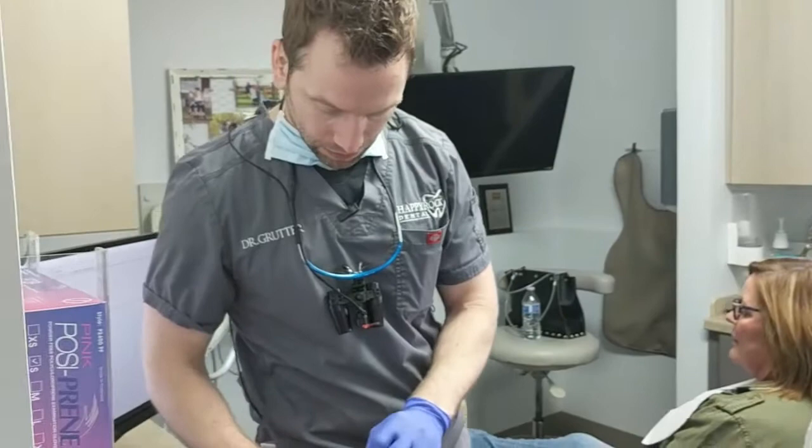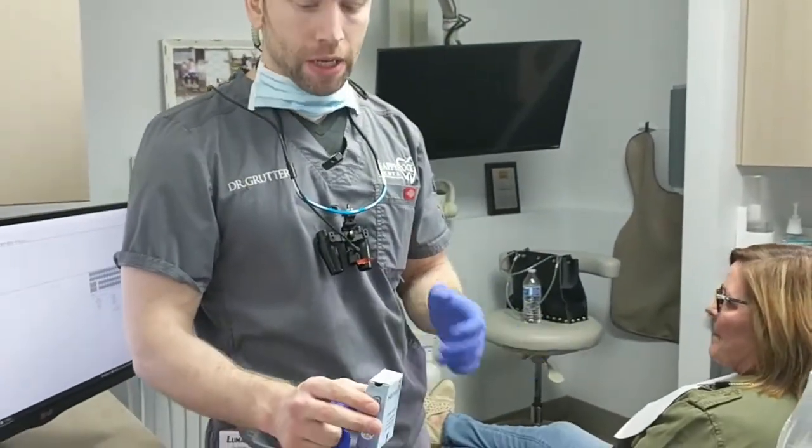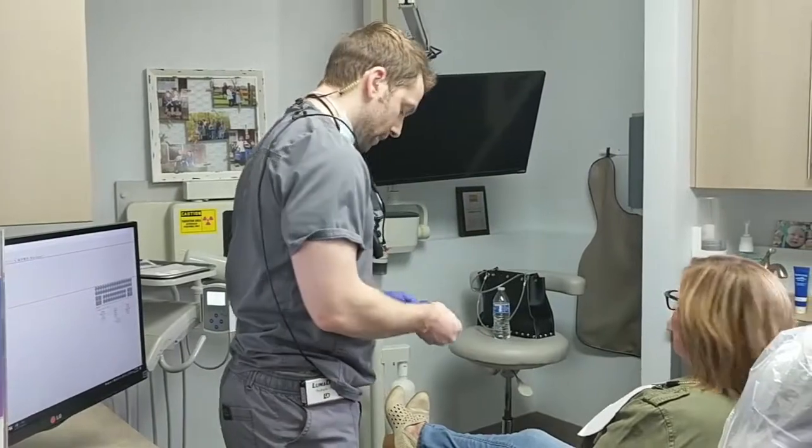I'm going to take these stickers. There are lots of them out there in the market, but this one in particular — as you pull it out, one sticker pops off, you pull it out, another one pops off. Just hand me your denture.